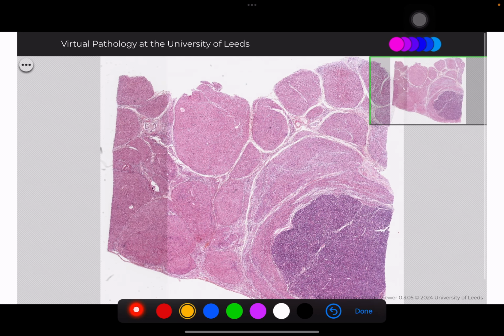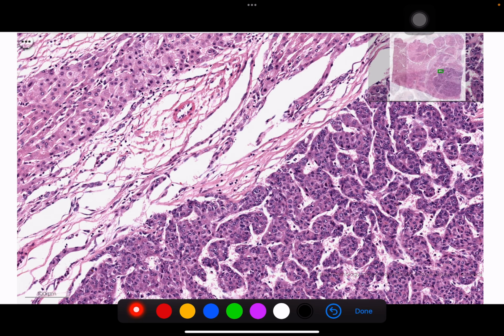When you open the link, you can see the background changes, which is that the liver is already cirrhotic, but there's a tumor there already. When you zoom in, you can see this is the normal liver, and in comparison, this is the malignant hepatocellular carcinoma.